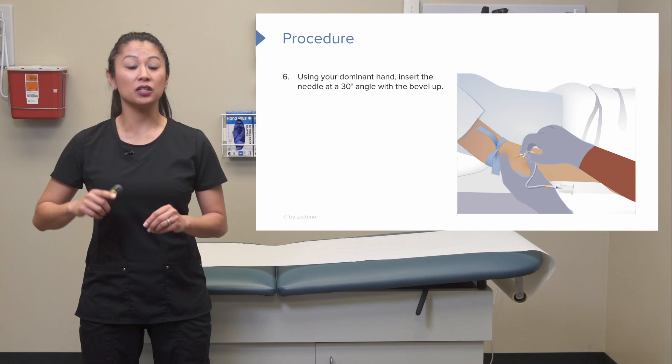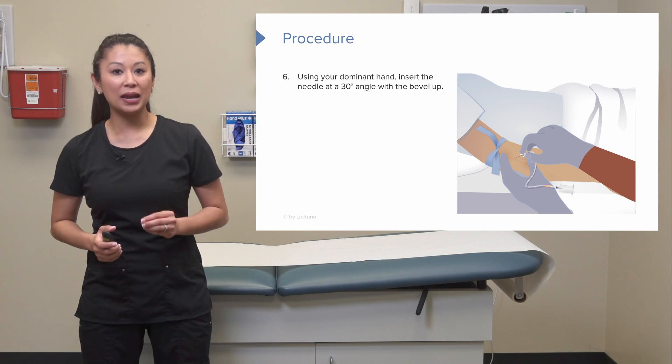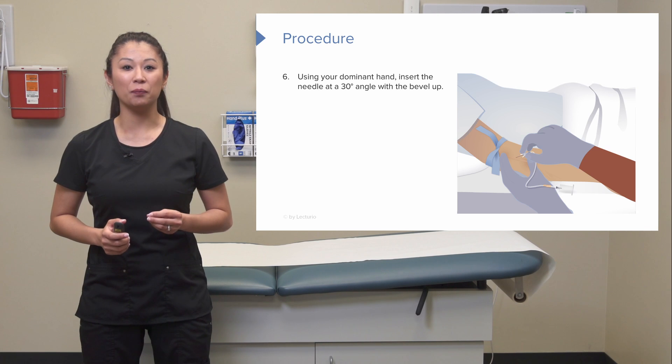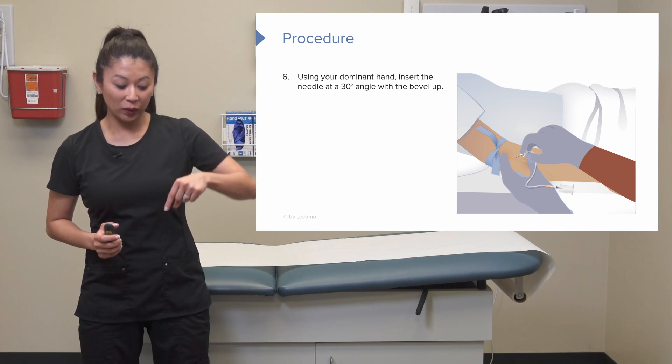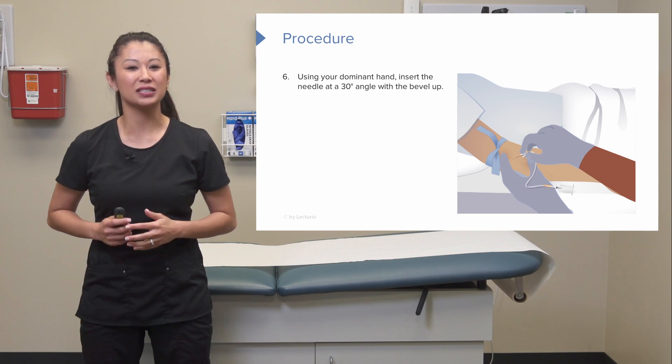We can use our dominant hand and insert the needle at about a 30-degree angle. Make sure that bevel is up. When we're talking about bevel up, you should be able to look down and see a little hole — that's how we know the bevel is up on the needle.